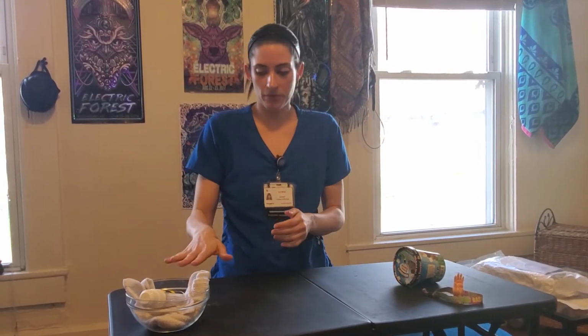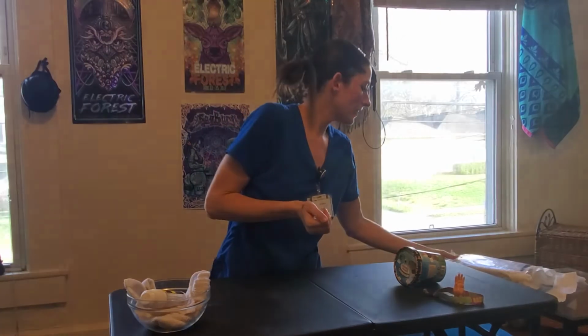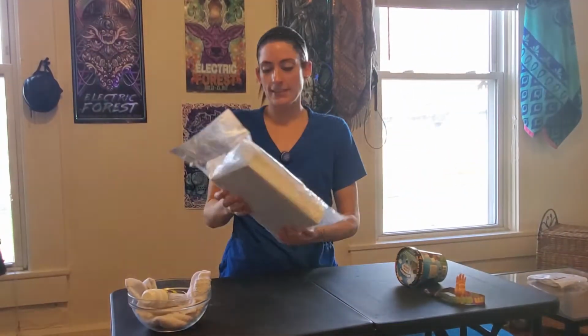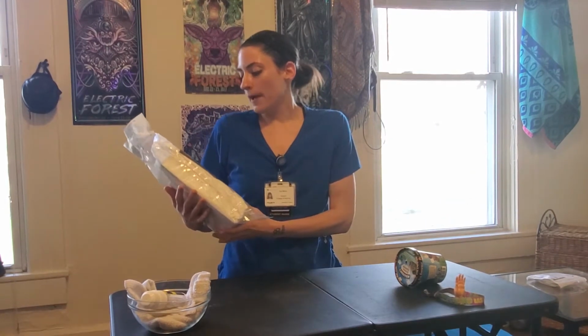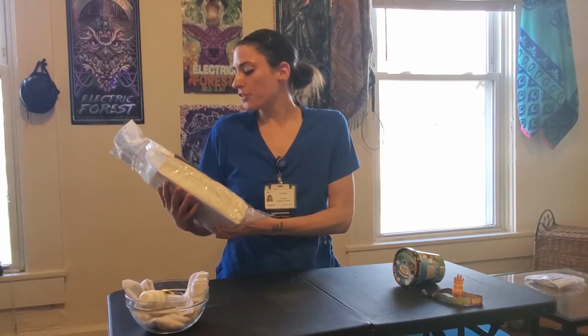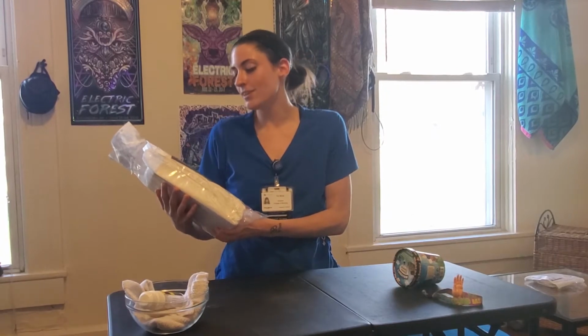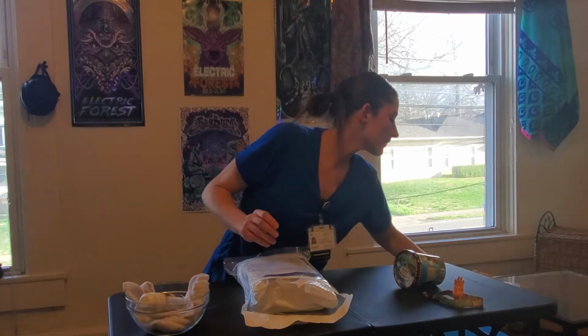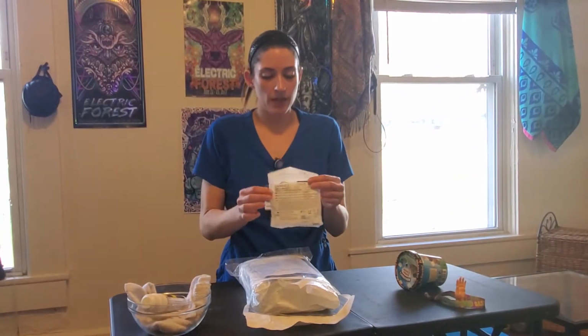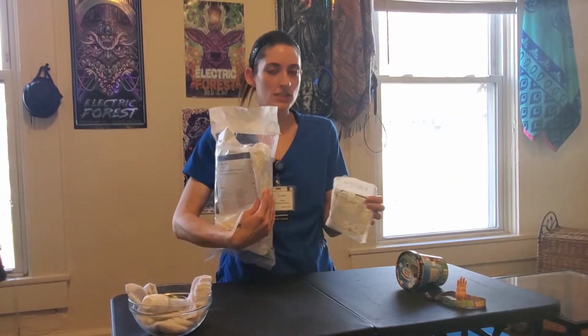So I'm going to perform hand hygiene, and I'm going to collect my supplies. I have some things for perianal care here. I also have a hydrogel coated latex Foley tray. It has a 14 French gauge with a 5 ml catheter pre-connected to a 2,000 ml drainage bag. I also have a pair of sterile gloves here. Both of these packages are intact and their products are not expired.